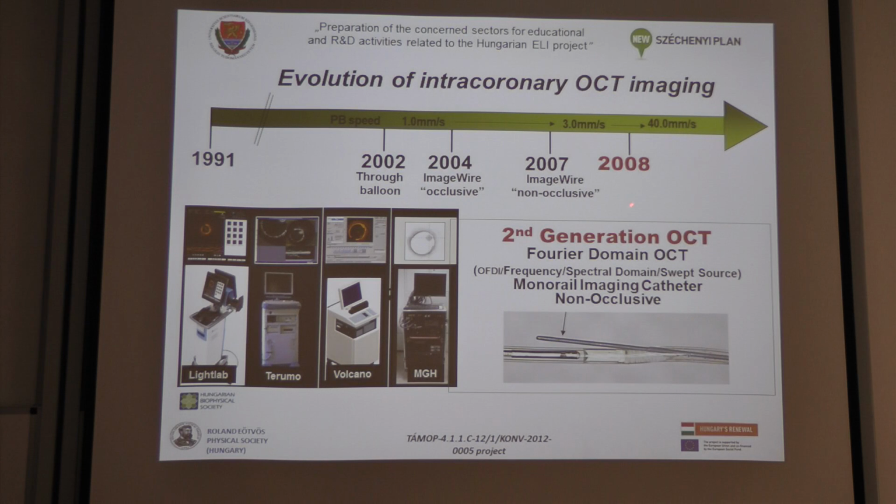From 2008 now it is available, and also in our cath lab for the last 4 years we've been using it quite often. For the clinical practice we cannot, since it's still expensive, even more than the intravascular ultrasound catheter.